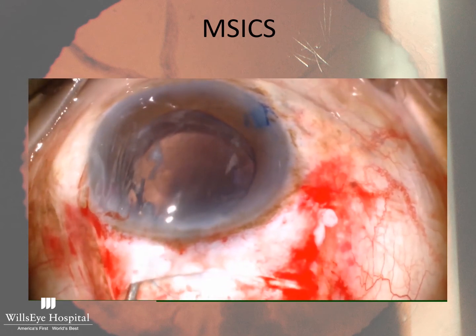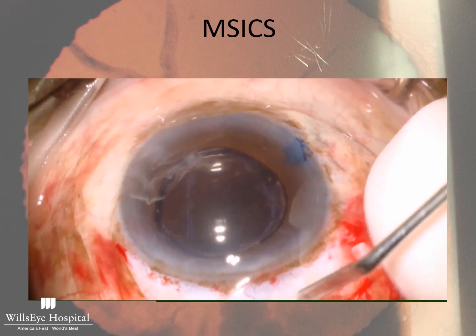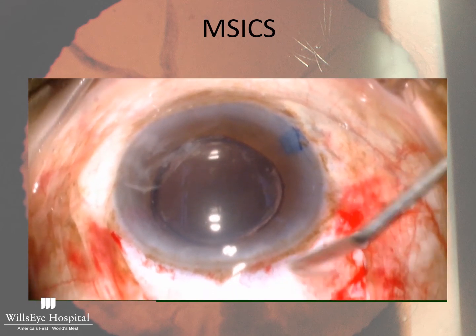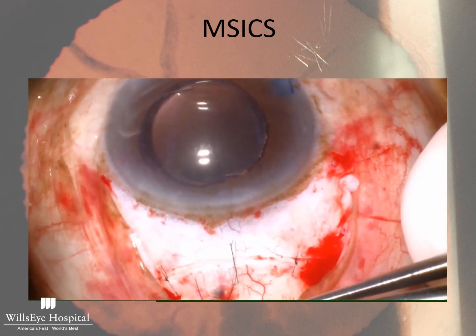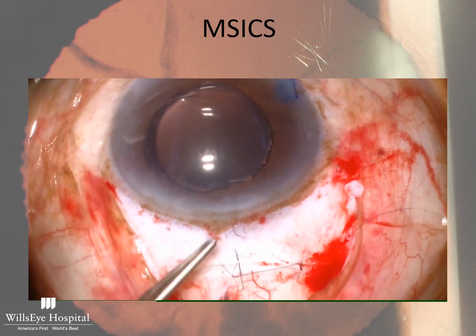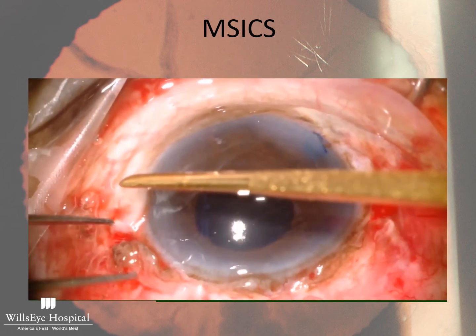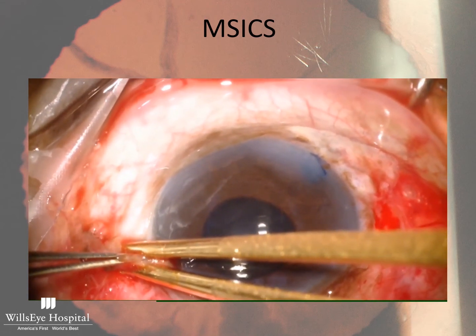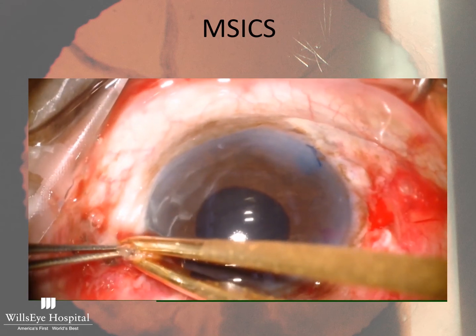This is a 3-piece IOL going into the capsular bag, and the wound is well sealed at the end of the case, although I often put sutures, 1 to 3 sutures, just to help me sleep better at night. And then I will close the conjunctiva with cautery. You can use Vicryl suture. So you can see here, no corneal edema. This patient will do quite well.